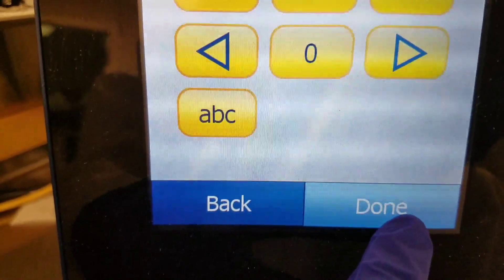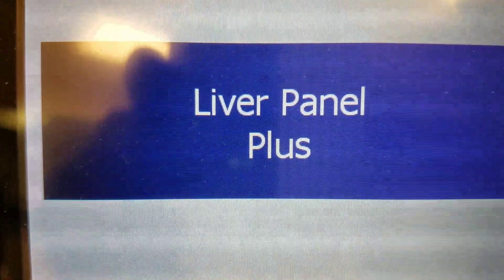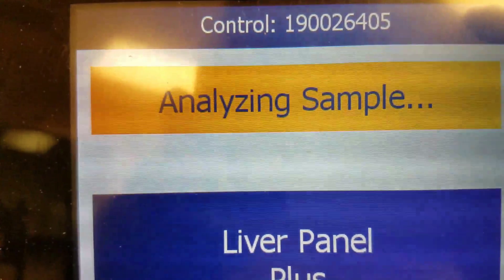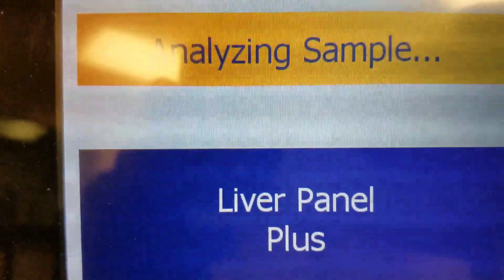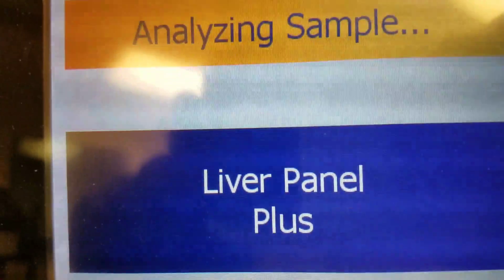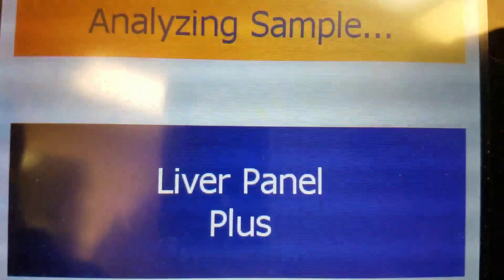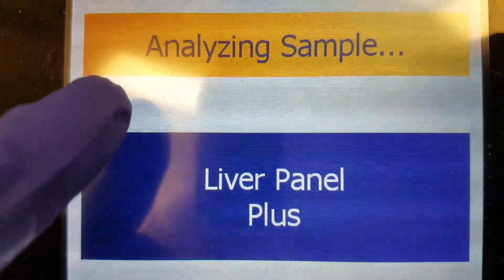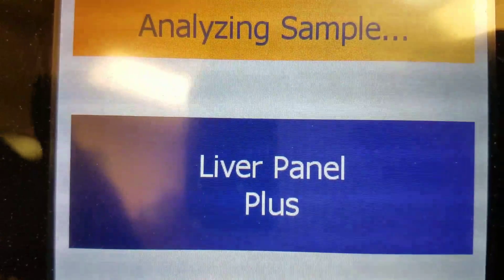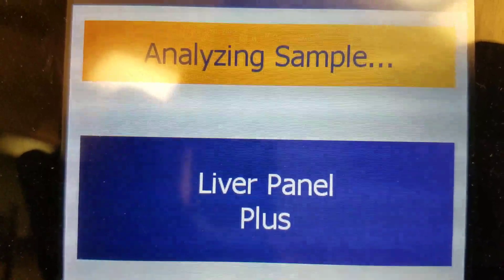Once we double check, those are good. It reads the cartridge and knows that I'm running the liver panel plus. And then it says analyzing sample and has my control number. As soon as it's done analyzing and figuring out what it's running, there will be a progress bar, and it will show how far along the test is done until it's completed. I'll show you guys what that looks like here in a minute.